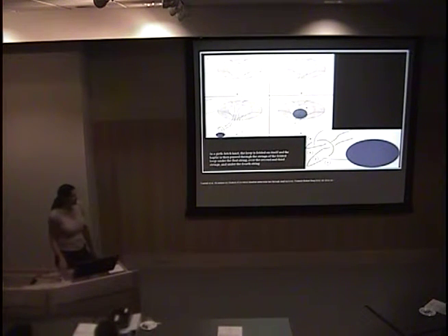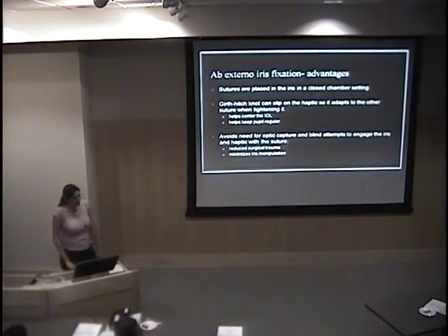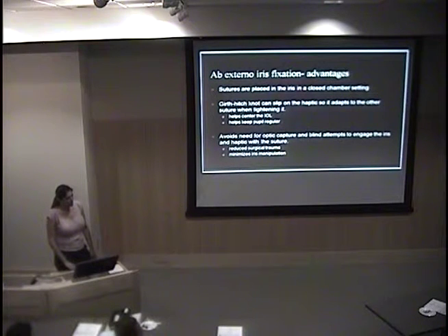It's just a common picture, because you've got a loop already. It's just a loop over and it comes around those two parts that flop down. Stick the haptic through it. As you pull it down, it pulls quite well. It's very innovative.